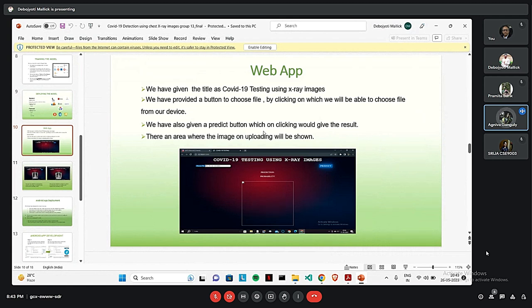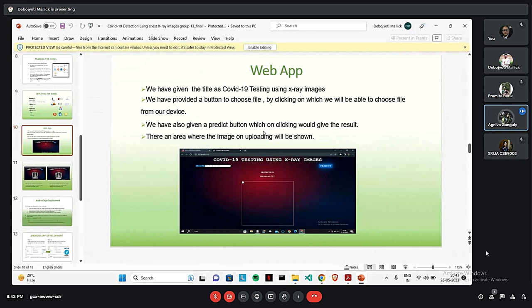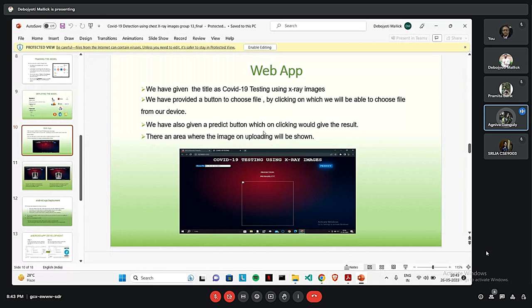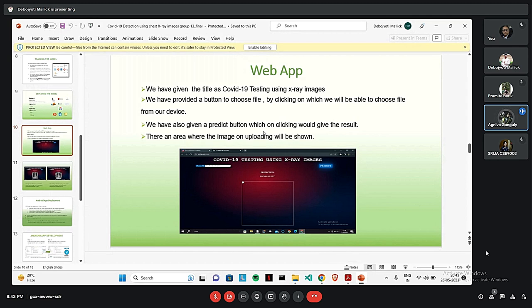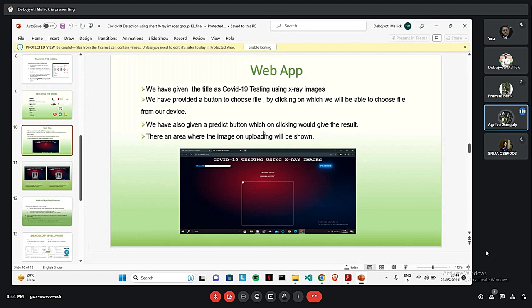That's how our web app homepage looks like. We have given the title as COVID-19 up on the screen there. And we have given the main title as COVID-19 testing using X-ray images. We have provided two buttons there. One to choose the file and one to predict, which will give us the result of the selected image. And there is an area where the image will be shown.